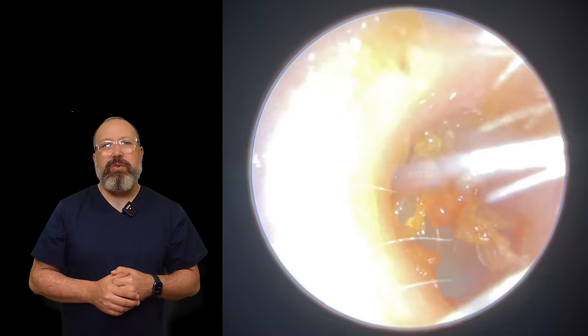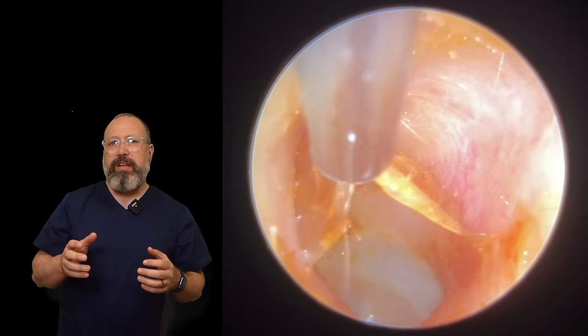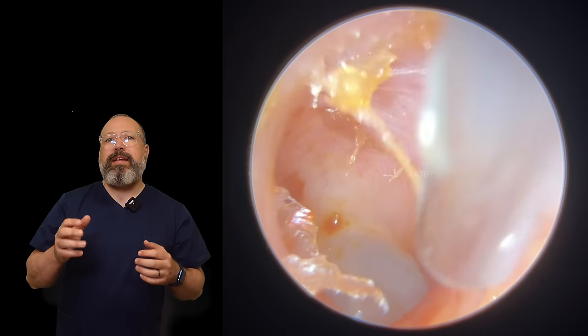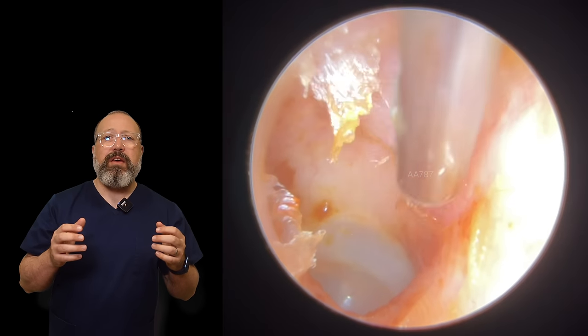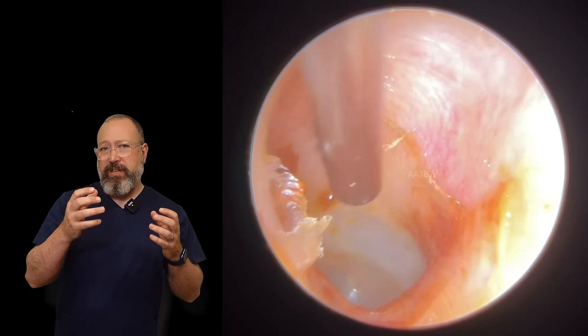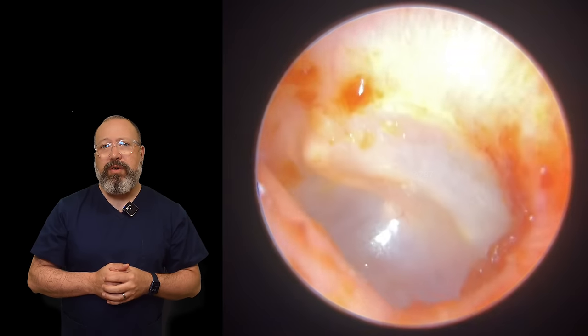We switched down to fine as soon as we encountered skin. A lot of the time I'll switch to the fine end quite quickly unless it's really tough, keratin-type skin — in which case the fine end just isn't going to be able to pull that out. It's come away really nicely.